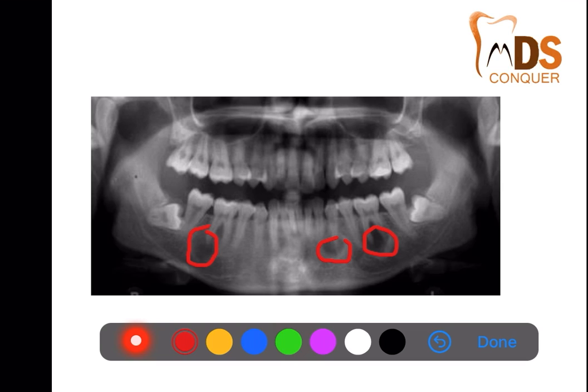Since the teeth are vital and there are no symptoms, you have to go for cementoosseous dysplasia. It can occur periapically — if present with only a single tooth it is called periapical cementoosseous dysplasia. If seen in one or more areas it is focal cementoosseous dysplasia, and if involving more than one or two quadrants it is florid cementoosseous dysplasia. It can occur in three stages: simple radiolucency, mixed radiopaque-radiolucent lesion, or completely radiopaque.